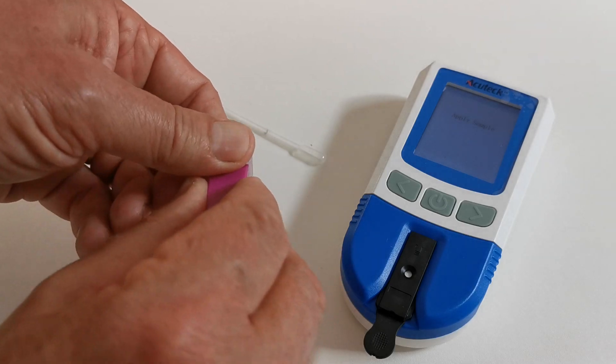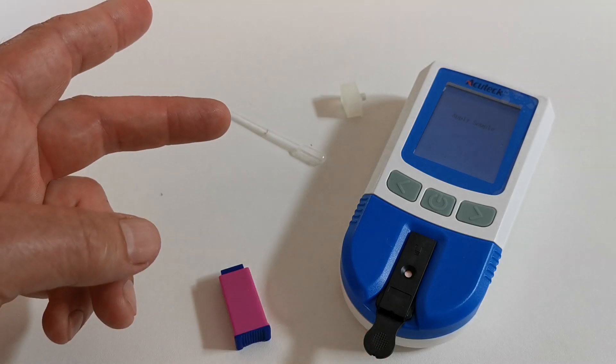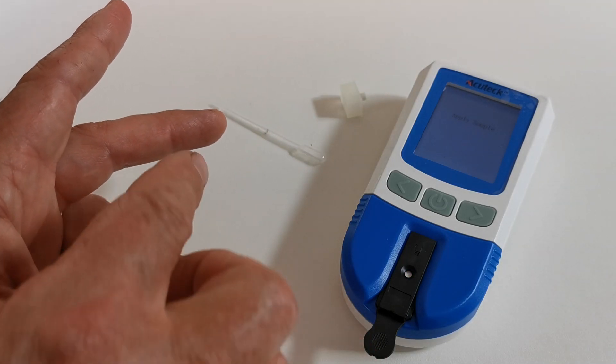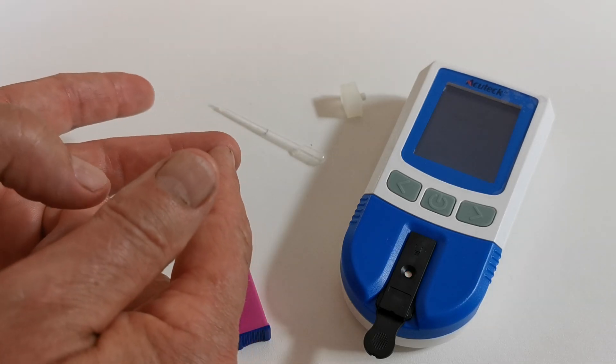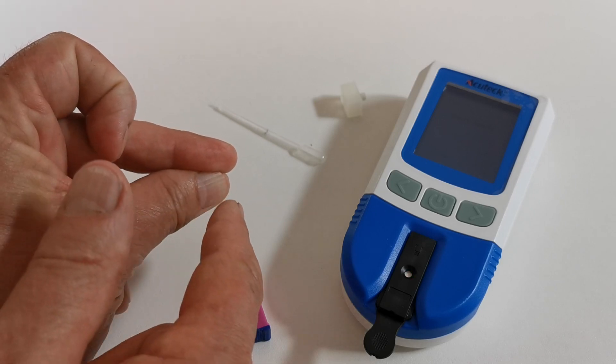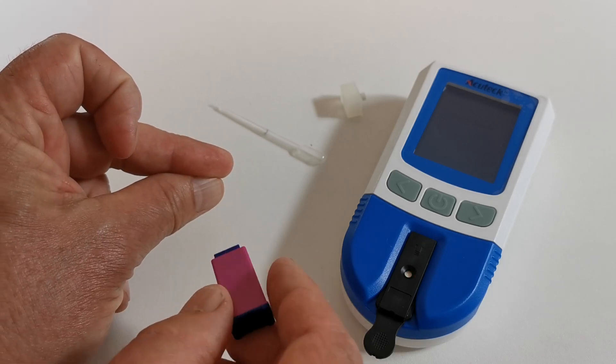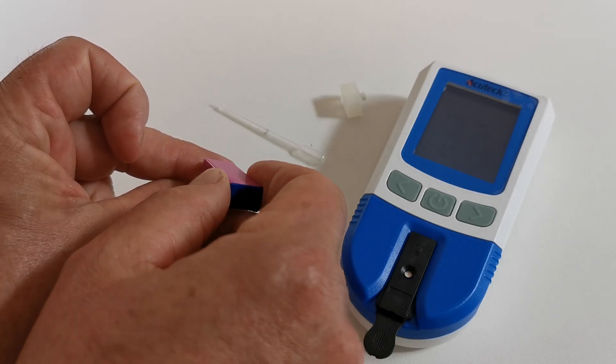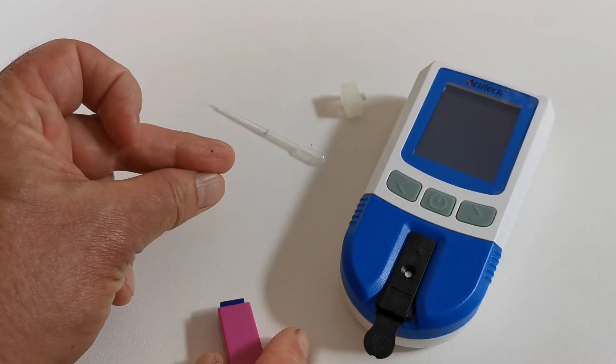When you're ready to do so, remove the cover from the lancing device. Select the area you're going to lance. We always recommend the side of the finger as opposed to the base. Support the finger underneath. My favorite technique is using the thumb just to pull the tissues around and forward. And then with a firm action, trigger your lance.